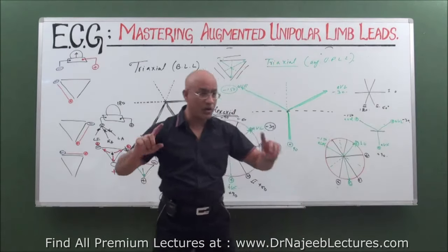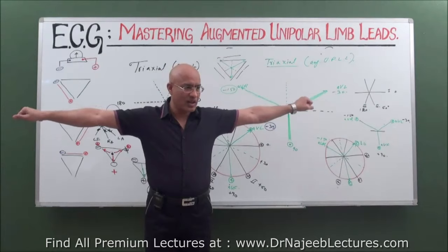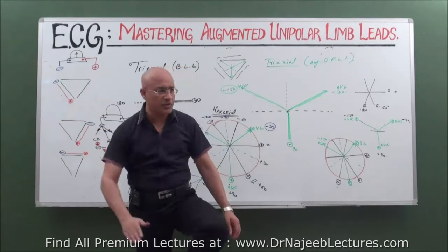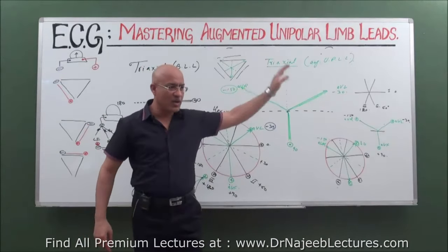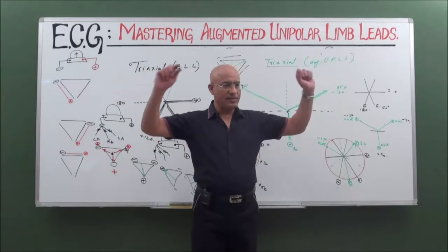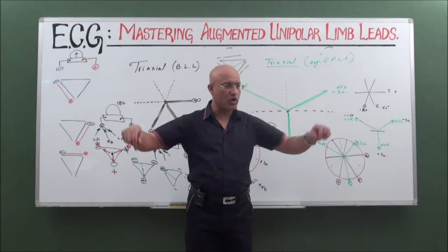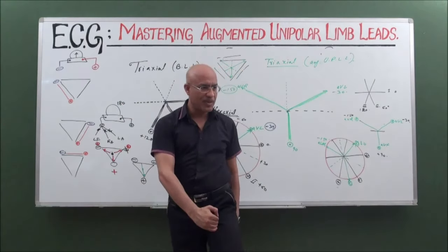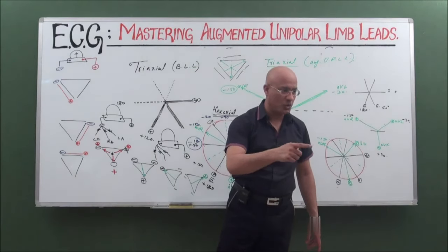Clear? Now rapidly: negative here and positive here, lead one. Negative here and positive on the foot, lead two. Negative here and positive here, lead three, bipolar limb lead three. Now, negative terminal made indifferent, positive electrode on the foot: AVF. Because we don't use Wilson for the limbs now. These days we use only Goldberger.